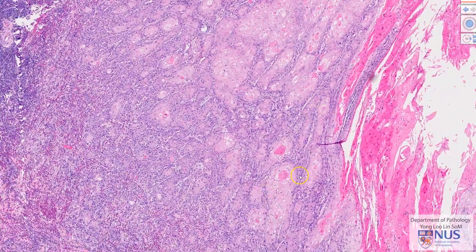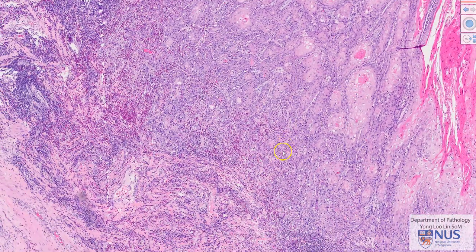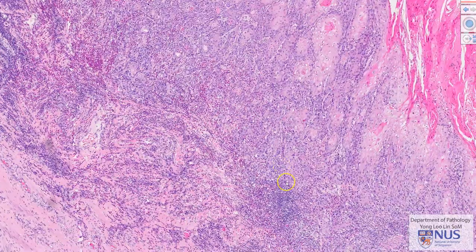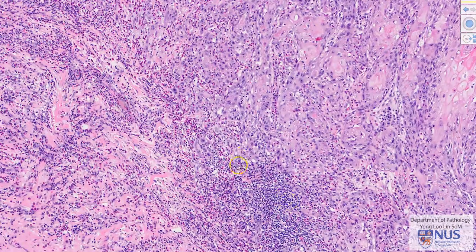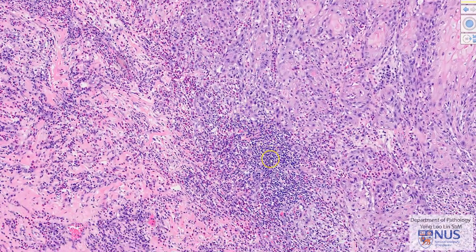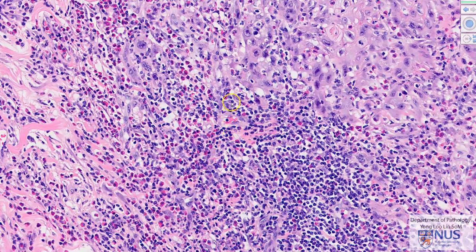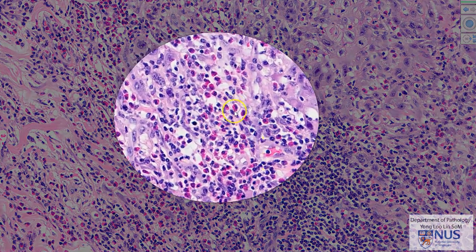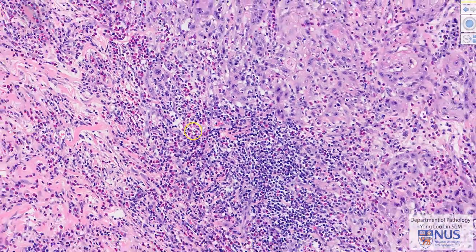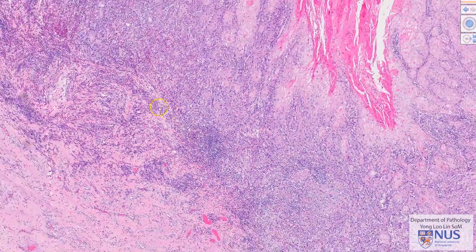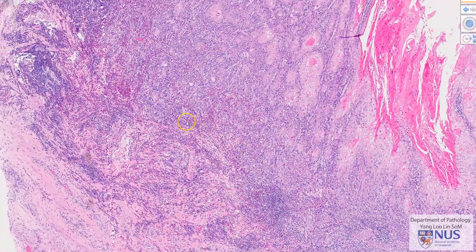As we look at the deeper invading front of the tumor, the tumor is actually inciting a marked inflammatory response. We can see lots of plasma cells, lymphocytes, and these bright red cells, or cells with bright red granules, which are eosinophils. These are present at the invading front of the tumor.